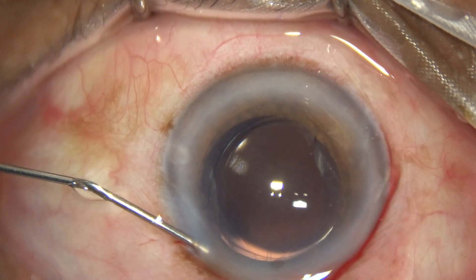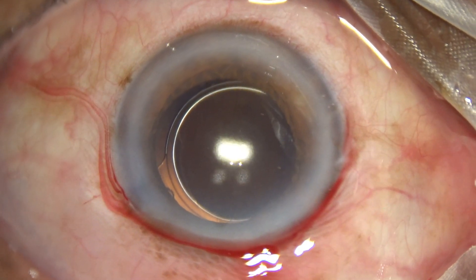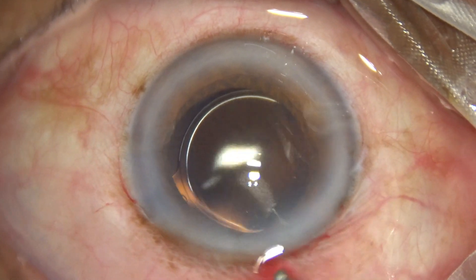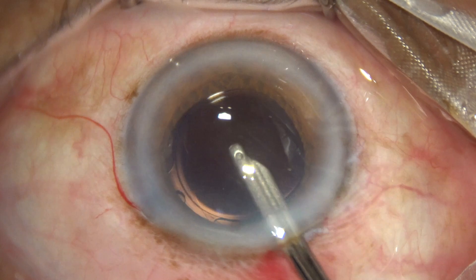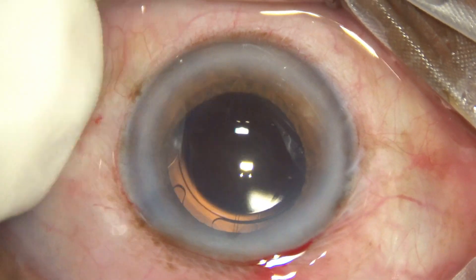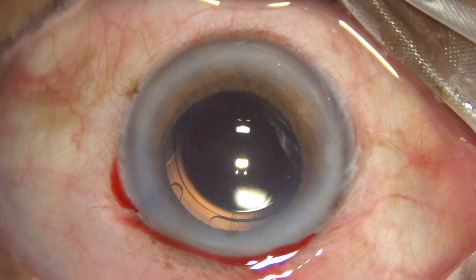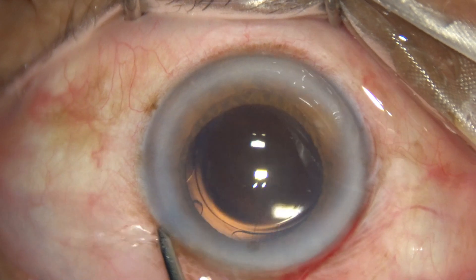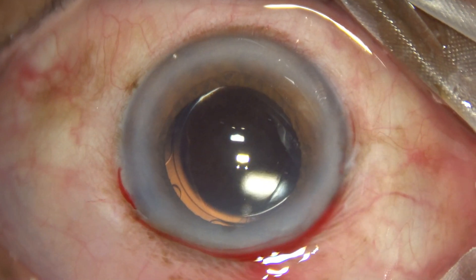The side port is closed and a final lavage of the anterior chamber is done. The anterior chamber is formed but the eyeball is still soft, so I introduce flow into the eye through the irrigation cannula at the side port area. The intraocular pressure is then checked and confirmed to be well-formed.